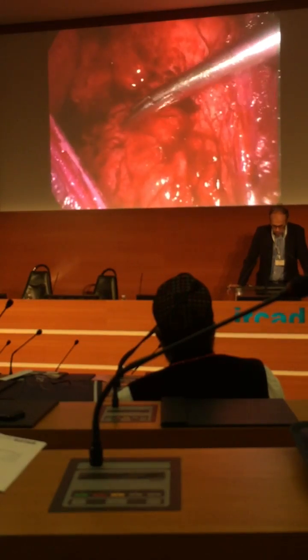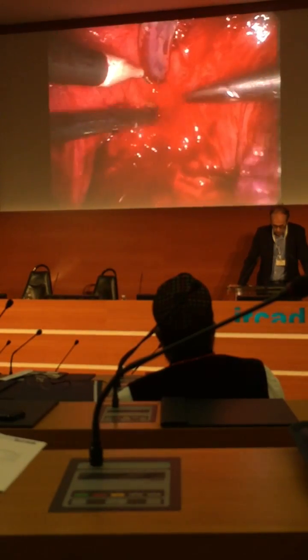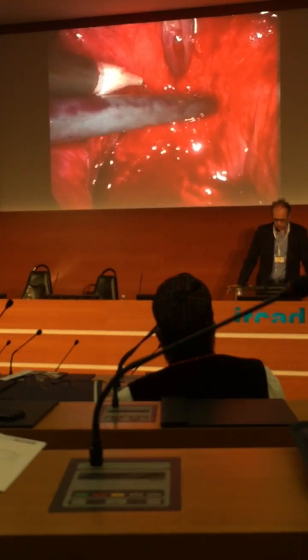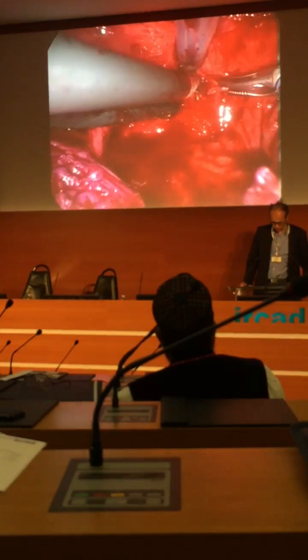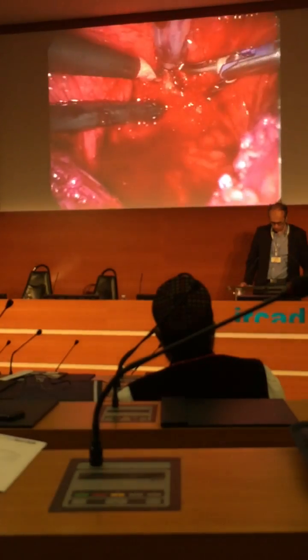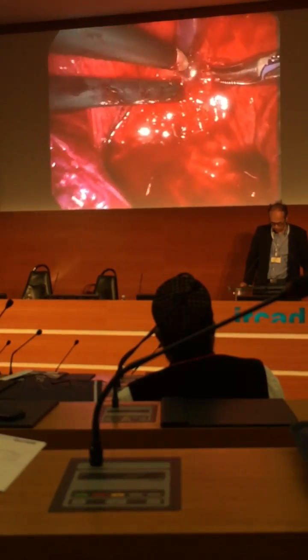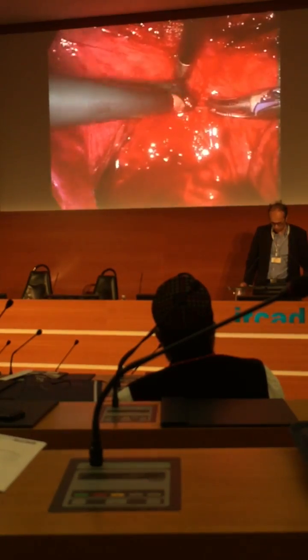So the two necks of the diverticula are closed now. And in this patient, Eric Mandron considered that there was a bladder neck obstruction, which was the etiology of the development of the diverticula, and he chose to perform a bladder neck incision, you see, by the laparoscopic approach.